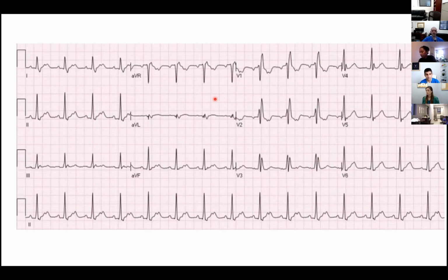So in order to understand one concept that I wanted to introduce to you guys, when you look at the P wave in atrial tachycardia, in a very simple manner, you will be able to differentiate: is this an atrial tachycardia coming from my septum, from the lateral sides? Is it from retrograde? Is it coming from the higher atrium?